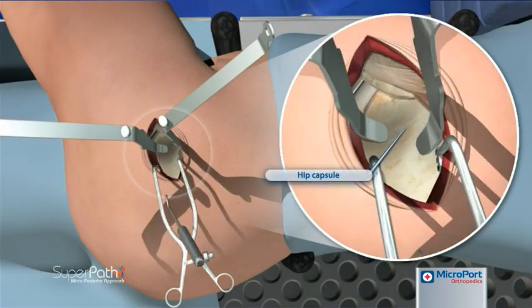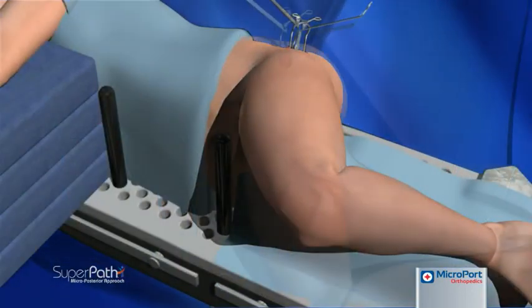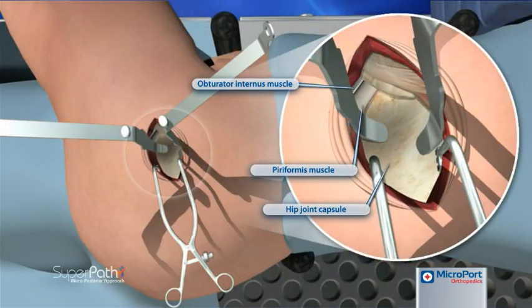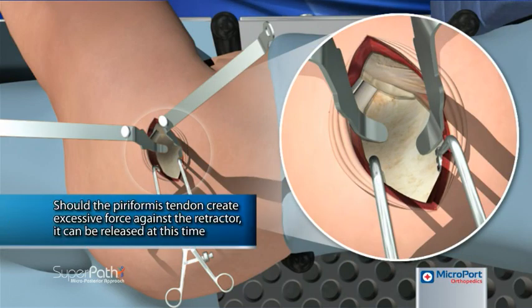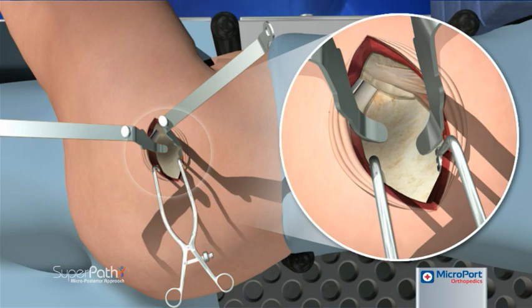The cob elevator is then replaced with a blunt Hohmann retractor, and the knee is lowered to return the leg to the home position. Gentle pressure is used to maintain the retractor's position between the posterior capsule and the external rotators. Should the piriformis tendon create excessive force against the retractor, it is then released at this time under direct visualization. A cob elevator is used to move the gluteus minimus anteriorly and expose the capsule.